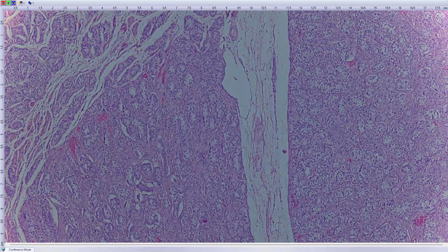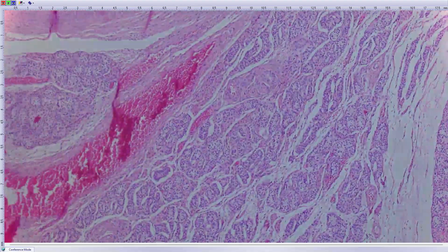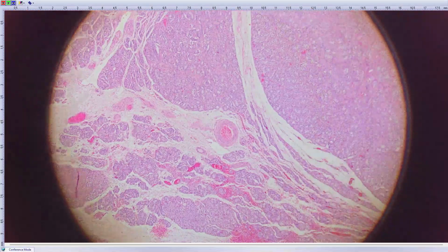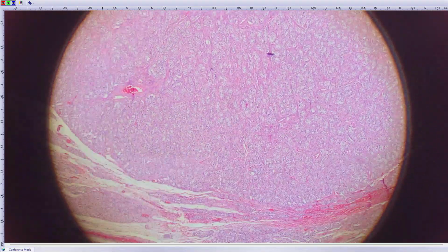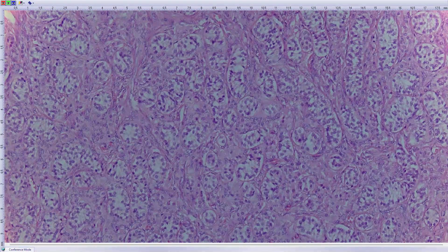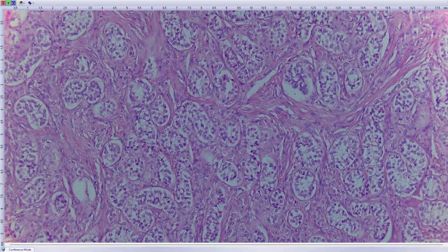So it means that there are no ovaries. Instead, there is something looking like testes, but not normal testes. There are almost no germ cells. These are Sertoli cell only tubules, which are present instead of the gonads. And sometimes these Sertoli cell only tubules form tumor lesions, which are called Sertoli cell adenomas or Pick adenomas. This is something which can maybe be regarded as this lesion, as it is well circumscribed from the surroundings. It is an entirely benign lesion, composed of just Sertoli cells. This is a tumor not similar to Sertoli cell tumor NOS. It is probably of non-neoplastic origin, rather of hamartomatous origin.